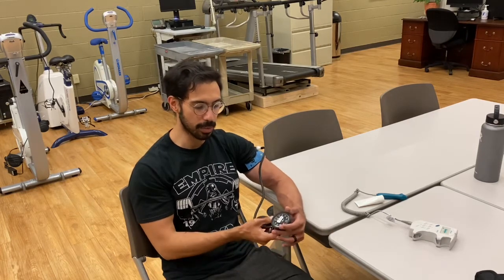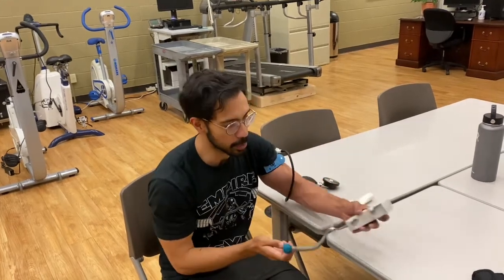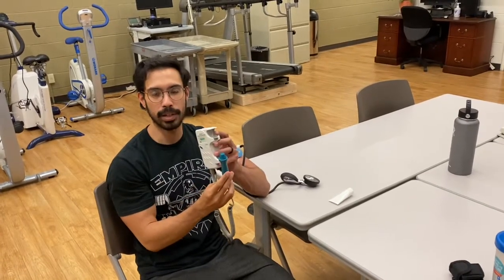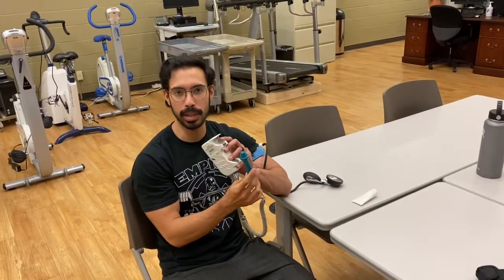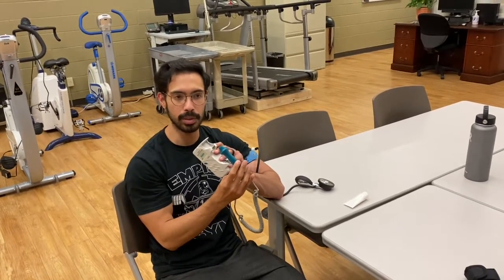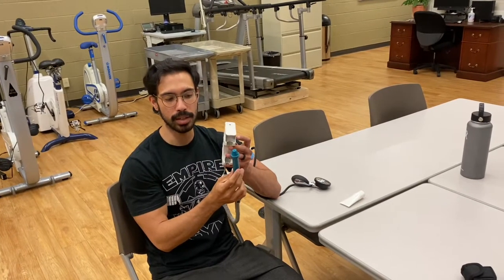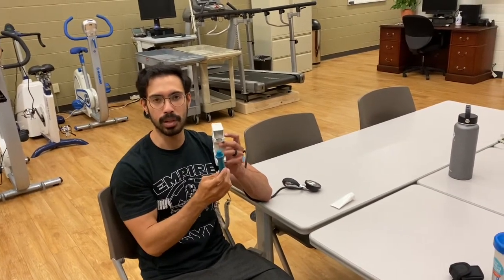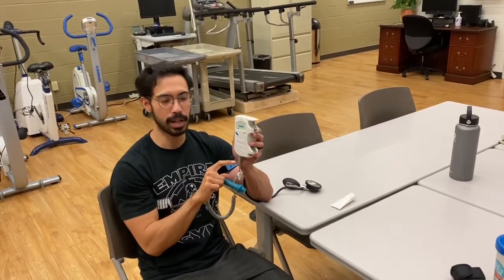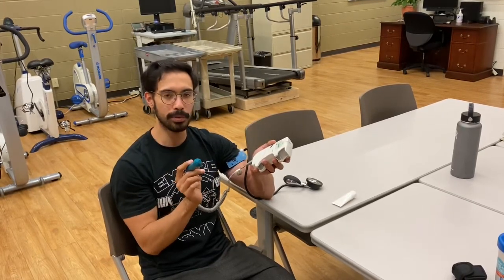So I wanted to start off by demonstrating how to use an ultrasound Doppler. This is a Doppler. You might be familiar with it in that you may have seen it at your OBGYN appointment or in a hospital setting. It's a lot more compact than your typical large-scale ultrasound. And what it does is allows us to hear the oscillations in blood flow using this probe and a little speaker that's actually attached to the Doppler itself. So this is the probe. The probe goes on top of the artery.